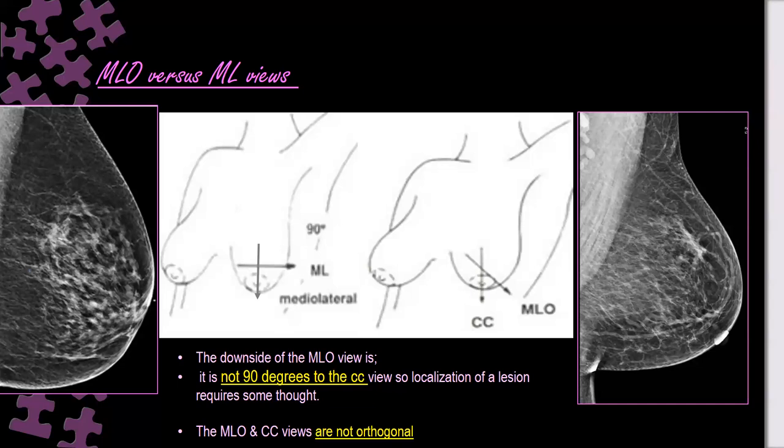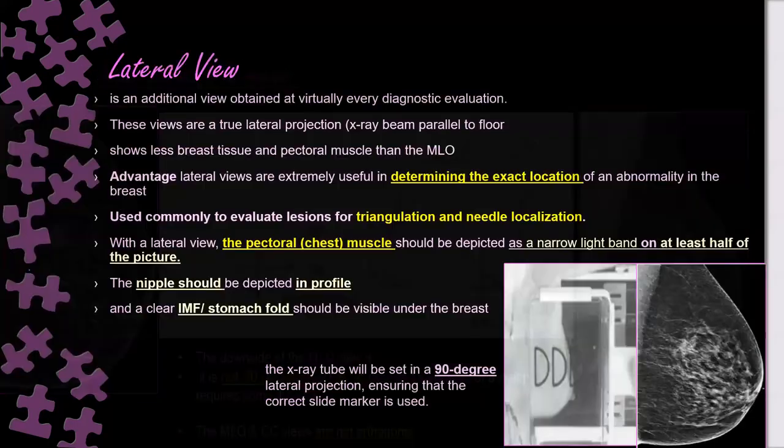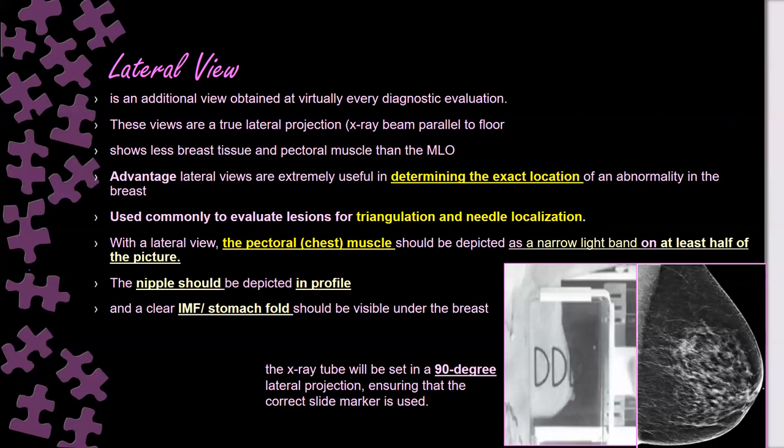Why sometimes do we select mediolateral and other times select lateromedial? It depends on what? Why is one preferable over the other at one time? We mentioned before, whenever the lesion is closer to the detector, it will be more appreciable. Yeah?